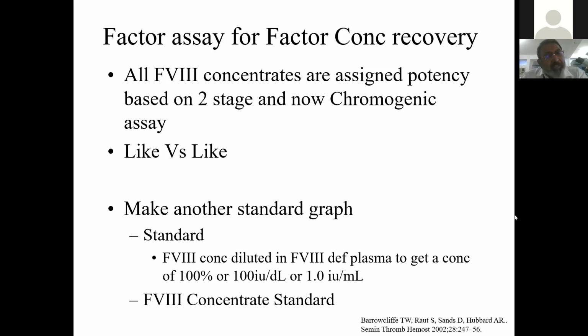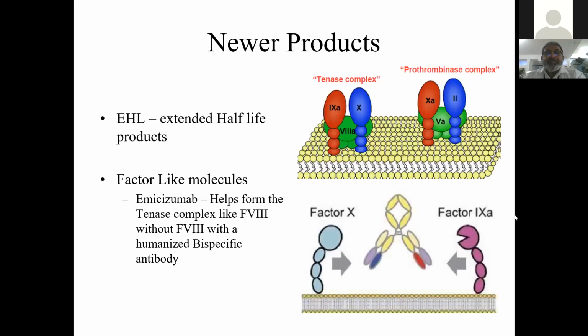So like versus like is as good as chromogenic. So adopt chromogenic only if you think it is mandatory, or if you cannot do anything else other than chromogenic assay for certain factors. So now you have newer products that have come, especially the extended half-life products.